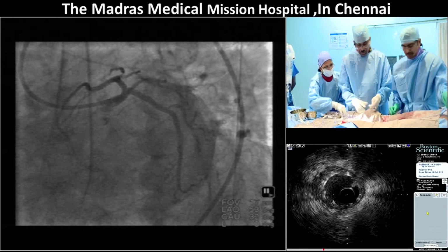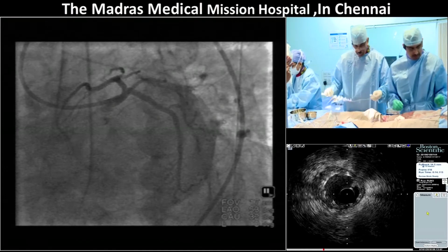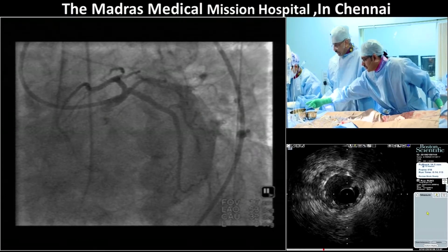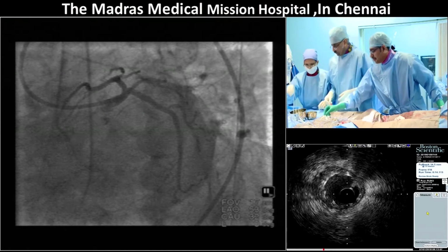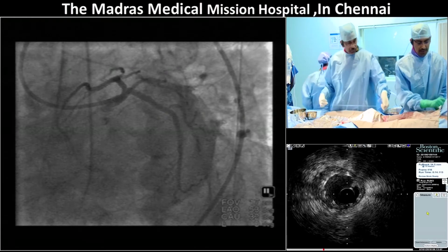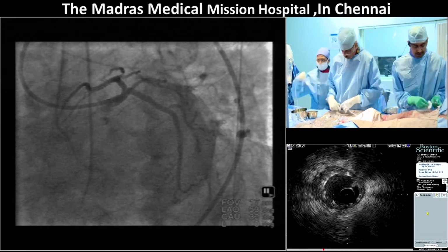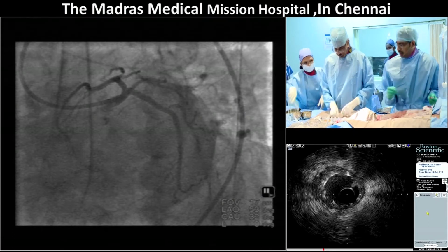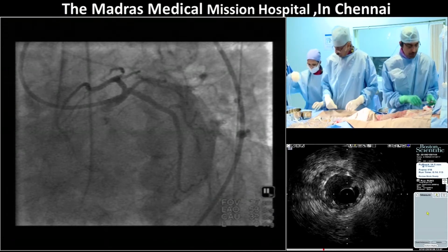Okay, so the plan now is to use the bilateral access. We've got the left catheter in, RCA guiding. So we gave 7,500 heparin to start with. It is almost half an hour now, so we're getting an ACT. Here we have to maintain an ACT of 350 and more.